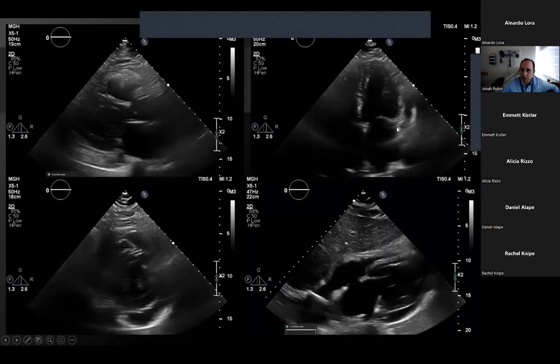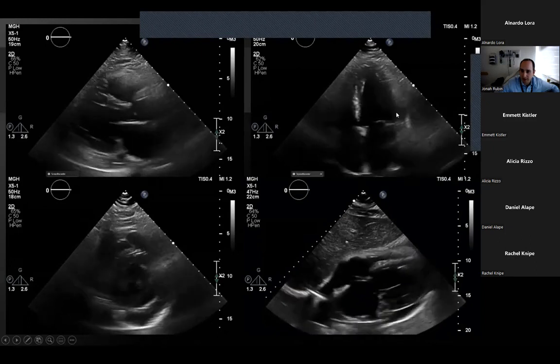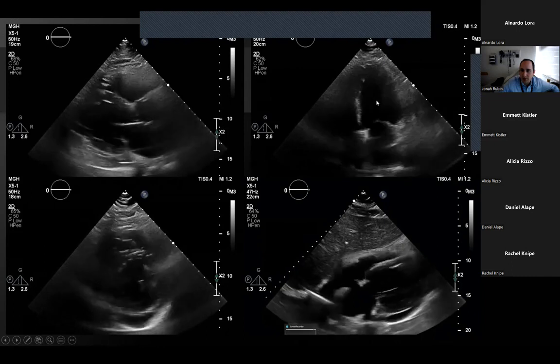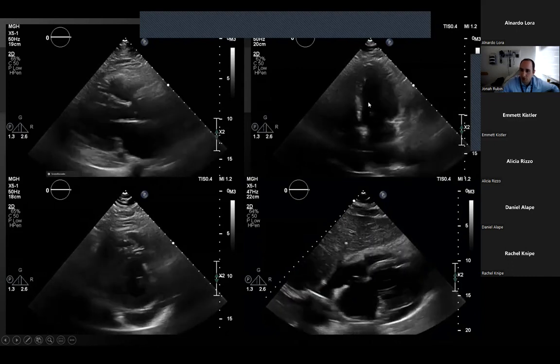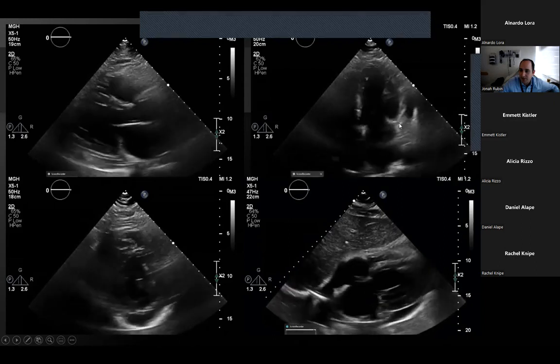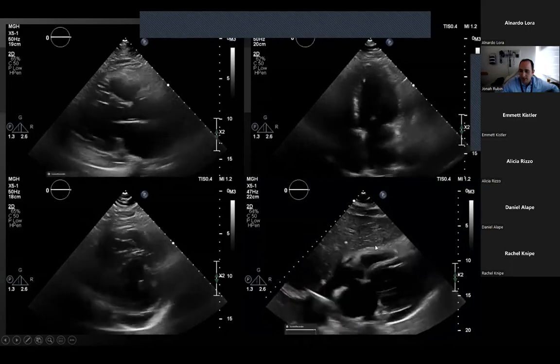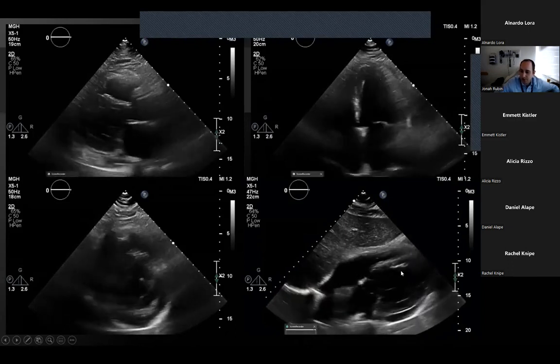And then you go to your apical four chamber and you're again able to see a lot of the same, corroborating that the walls are not thickening very much. The chamber contraction, maybe you haven't yet developed an eye for whether that's normal or not, but you're seeing that the mitral valve annulus, even if you're not measuring a MAPSE, is barely moving, not rigorously. And here we have a subcostal four chamber, and again there's some movement.